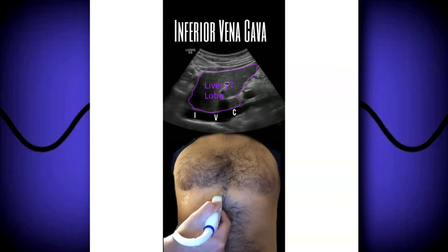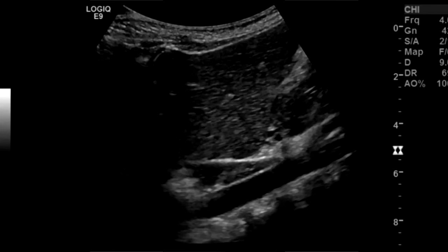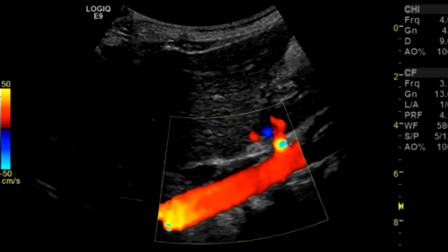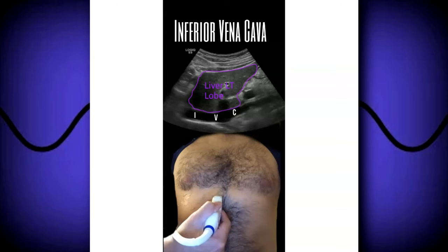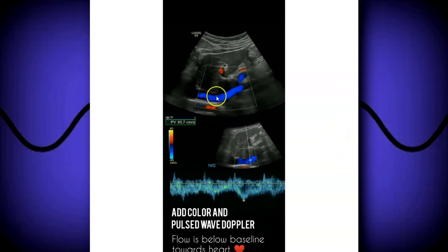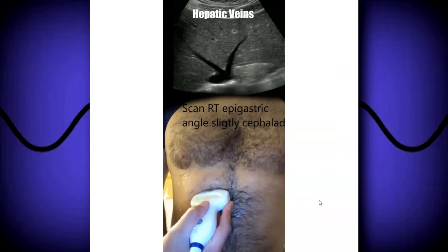You can begin with the IVC — every place will have a slightly different protocol. You could also include the aorta. You can begin with the IVC right behind the left lobe of the liver, scan midline slightly to the right, and you'll see the IVC posterior to the caudate lobe entering the right atrium. Take a grayscale image, a color Doppler image, and a spectral Doppler image. The flow should be towards the heart.